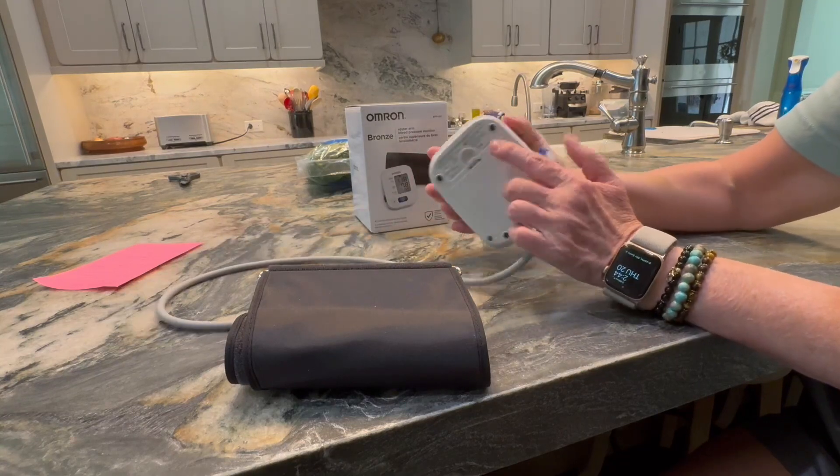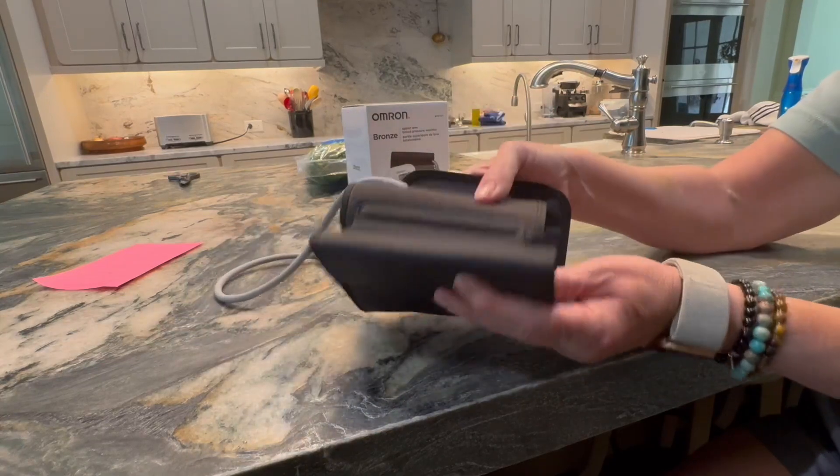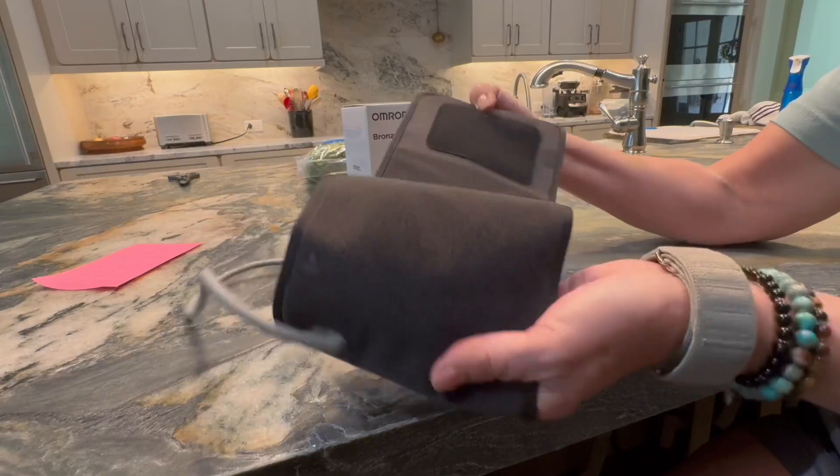The batteries go here in the back and when you get it you just have to pop this piece in right here. This is the cuff and it's a Velcro D-ring cuff that's adjustable.